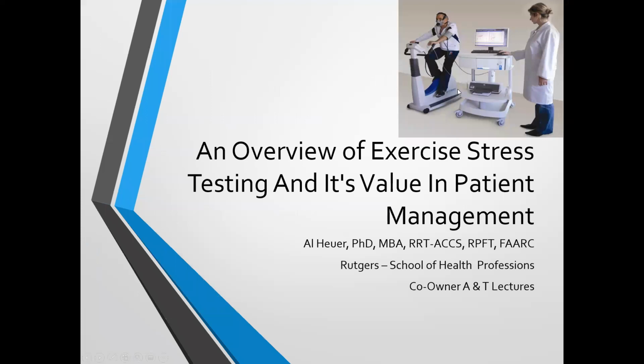this image that's actually on the greeting slide here shows you probably a pulmonary function technologist, a registered respiratory therapist. It shows you a quote unquote patient who's on an ergometer, okay, an exercise bicycle, also with equipment to measure things like inspired oxygen levels and the amount of CO2 that's produced, done with a mask that's strapped to the face there. And then the computer does a couple things.